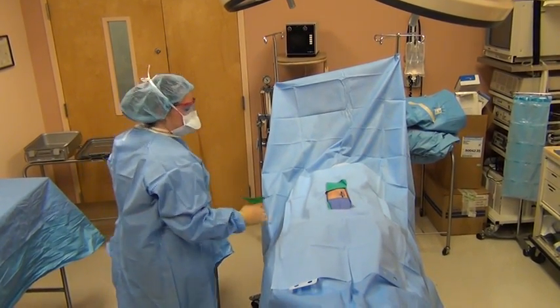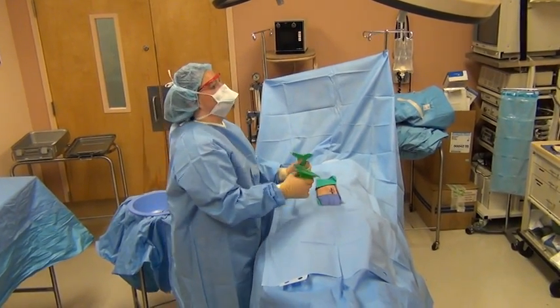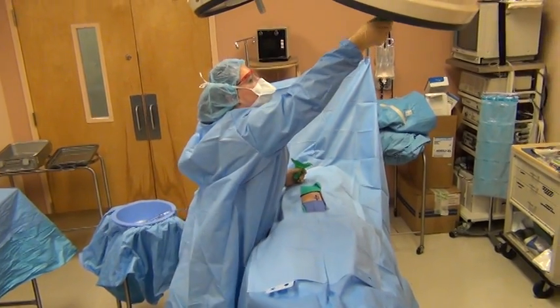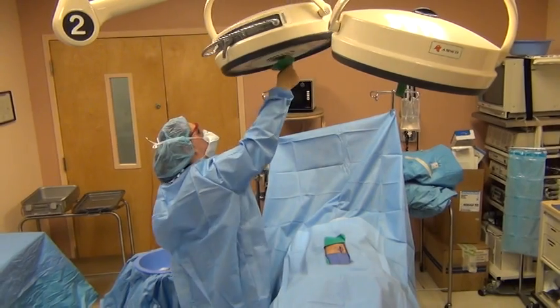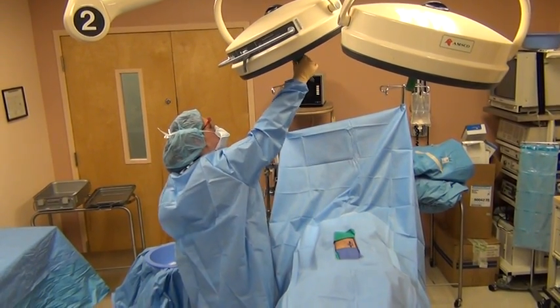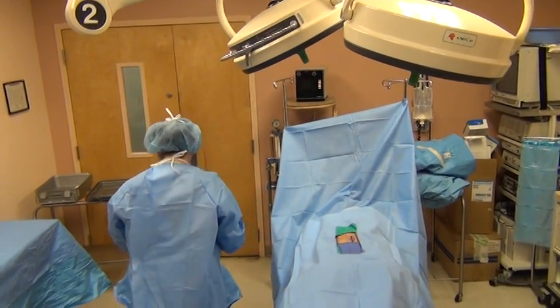Okay, once your patient has been draped, now you are ready to place the light handle covers on. Sometimes they'll be different at different hospitals, but you just work with what you've got.